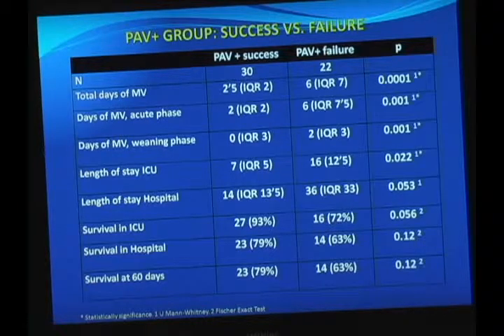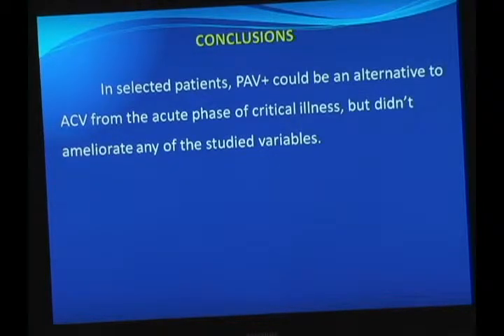But this is only the confirmation of what kind of patients we have. So it only helps the patients who don't need any other ventilator, maybe, or at least so short term, that the best way is to get them out of the machine rapidly. Yeah, sure. But we also failed to find differences in the need of sedation, in the ability to get off the ventilator even faster.